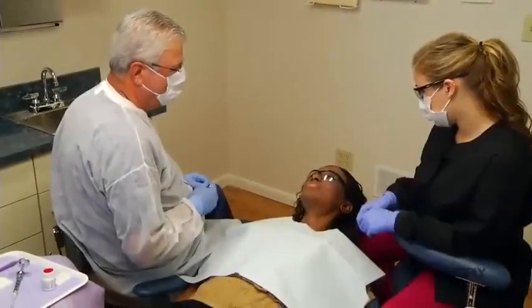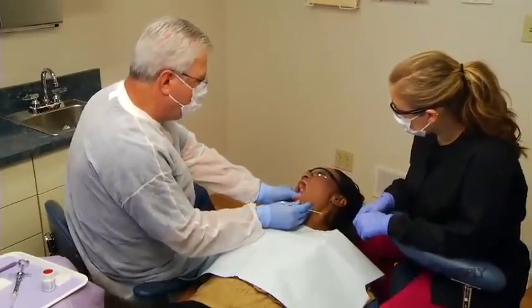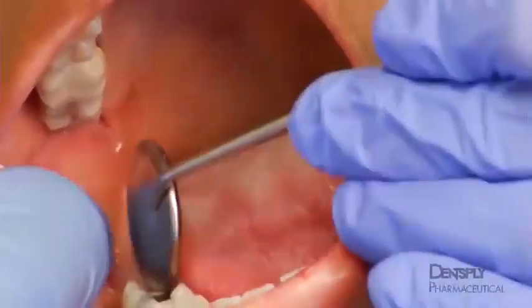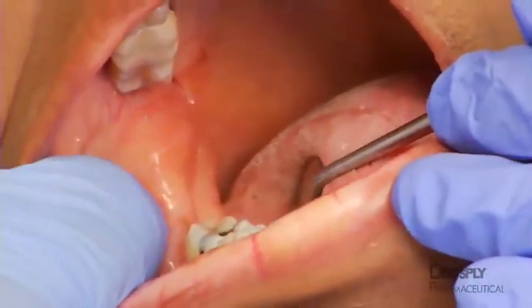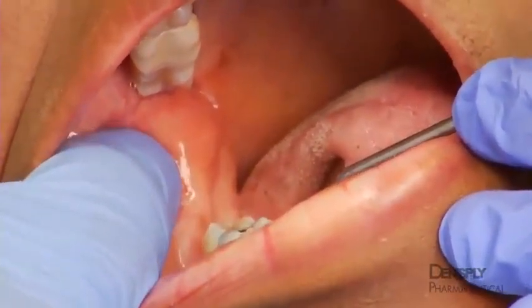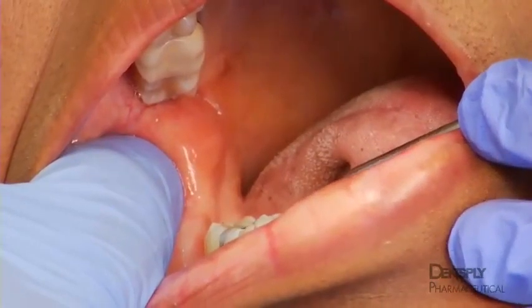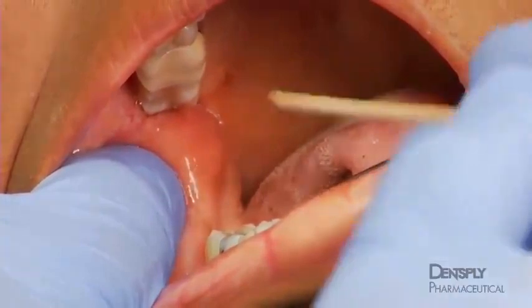Clinically, the coronoid notch is determined by palpating the most lateral aspect of the anterior ramus. Here, the thumb, kept parallel to the mandibular occlusal plane, is moved into position within the coronoid notch. A line bisecting the thumbnail establishes the height of injection.